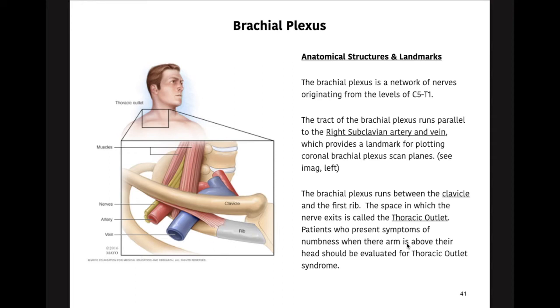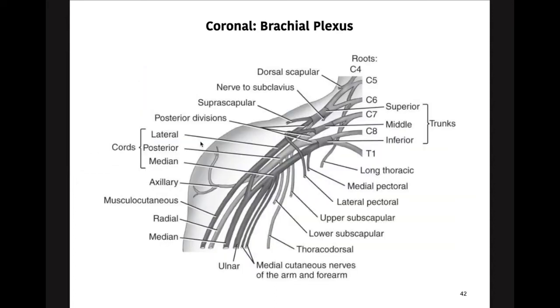The main concept here is that the brachial plexus comes out of the neck at the level of C5 to T1 and passes through the thoracic outlet, extending a bit more laterally as we can see on this coronal brachial plexus view. There are three separate trunks: a superior, a middle, and an inferior.